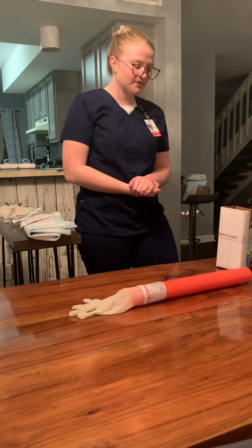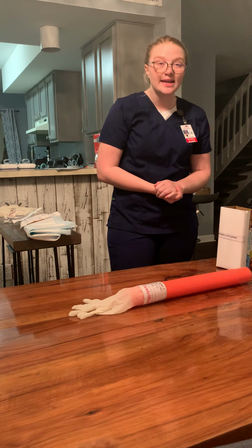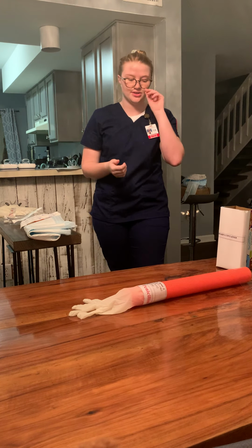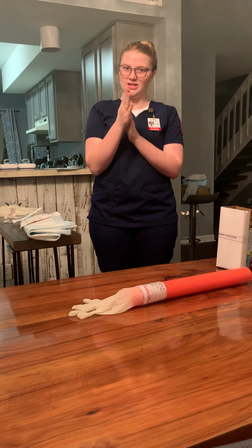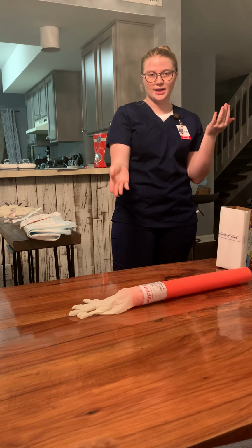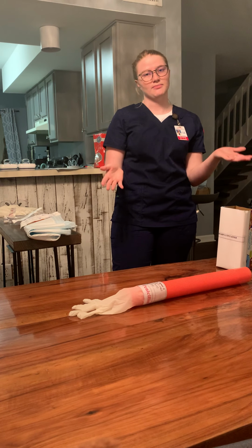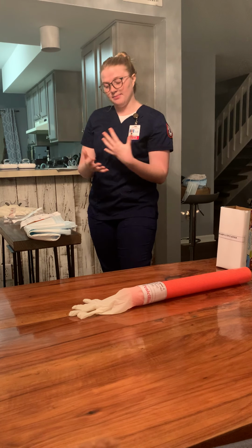And so I'd explain the procedure to the patient. Mr. Jones, I'm going to be inserting an IV today. I'd provide the patient with as much privacy as possible, shutting any doors or curtains. I would position the trash can, perform hand hygiene again, and then I would raise the bed to an appropriate working height, lower the side rails, and the patient can be lying supine or sitting up in a sitting position.